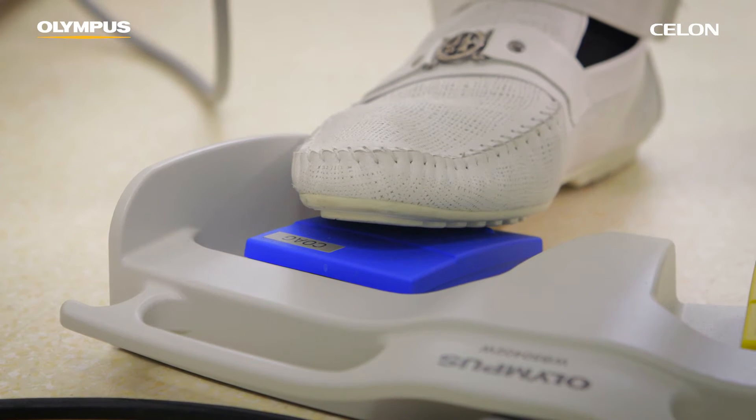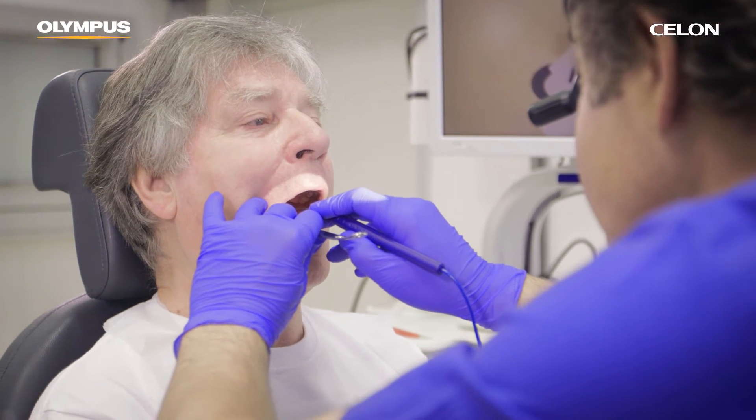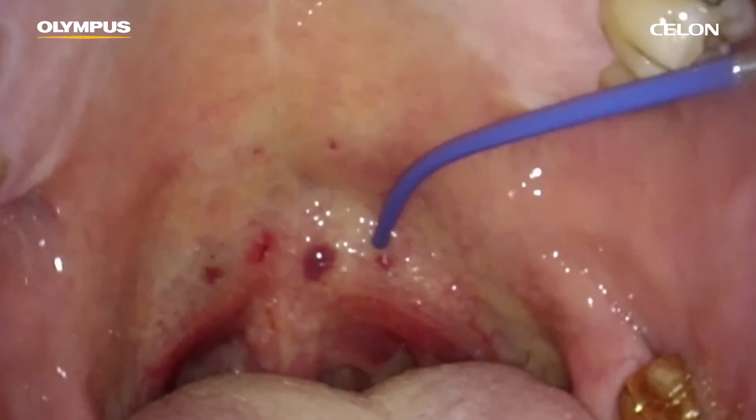After positioning the applicator, activate the power supply by pressing the foot switch. You can monitor the status of coagulation via the acoustic signal. The power supply is reduced automatically to prevent overdose effects.